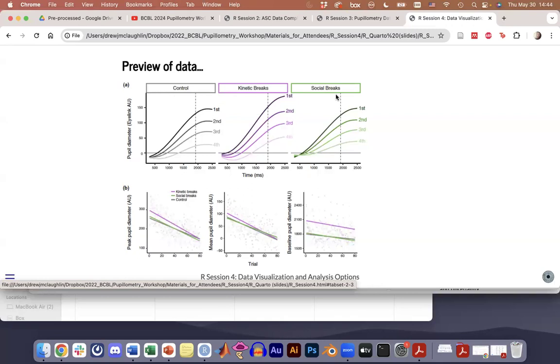And we can look at this across conditions. We did another set of analyses because, as I was describing at the beginning, this field has been changing, and pretty much all of the papers preceding ours were doing summary statistics. So we were encouraged by a co-author, and then also during the reviewer stage strongly encouraged, to do what everyone else had done previously, essentially. I don't think that will be the case moving forward, and I do not think it is necessary to analyze a data set two ways. So I want to clarify that. I am not suggesting you do summary statistics and growth curve analysis. I recommend you choose one and follow through with the analysis.